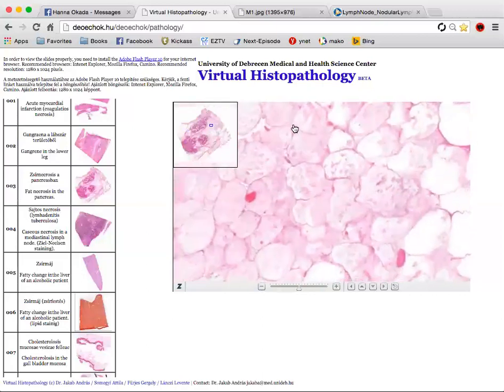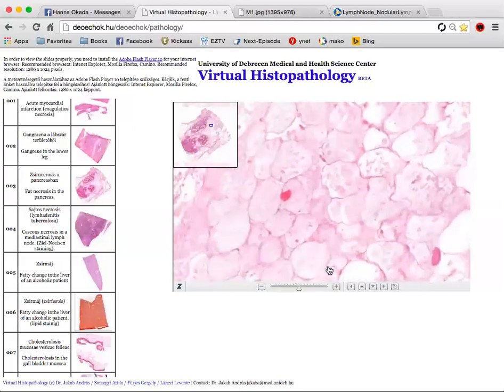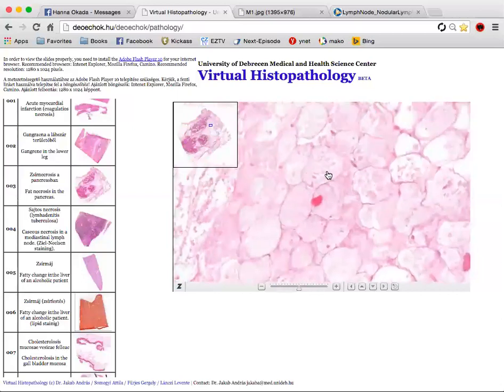You can see that these are adipocytes, but the membranes are kind of ruined. They're a little necrotic, and you can barely see the cell nuclei. You can see maybe one here and maybe one here, but this cell doesn't have a nucleus. So this is necrotic.